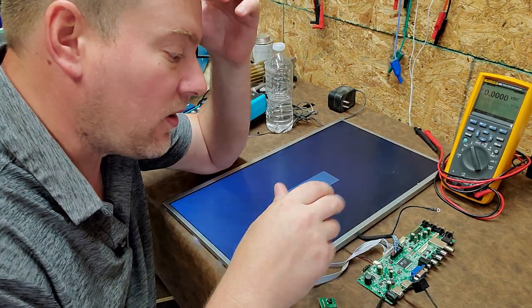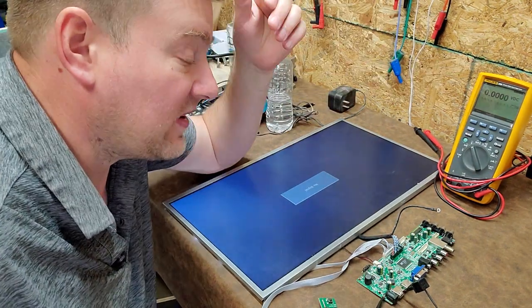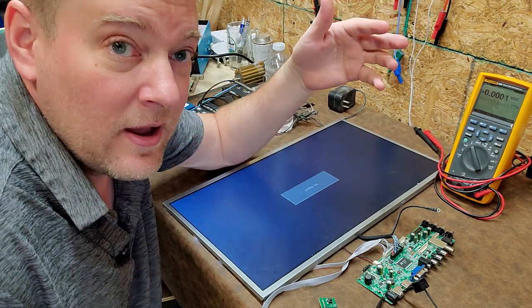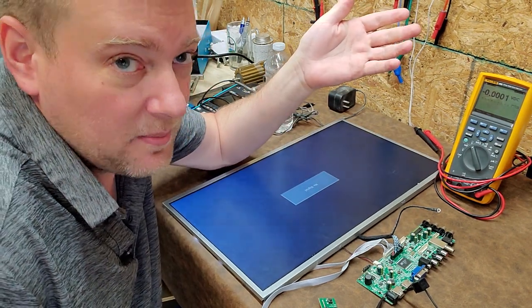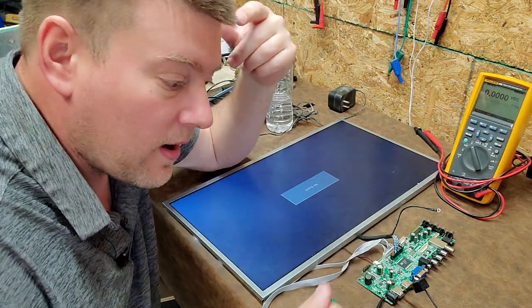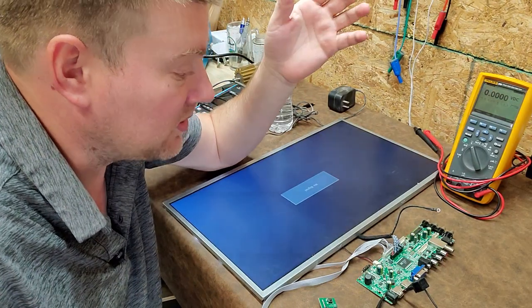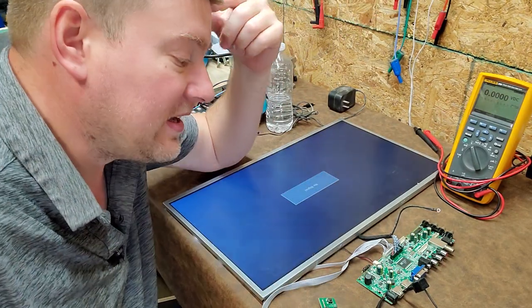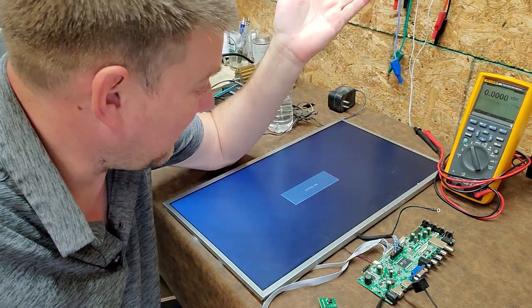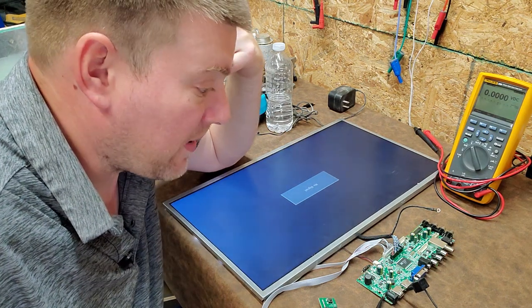So I can't verify that, but what I can say is that this device currently is ready to be tested. Now, what you can do is if you don't have a multimeter to test out your DC power supply, you can always move the TV to a neighboring patient room and try and plug it in and see if it powers up. Always use local resources, if possible, to help you troubleshoot. But the blade connector probably was maybe part at fault, but as far as I can tell, this guy here looks like it's ready to power up.